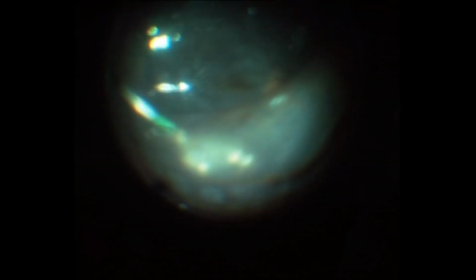The last case highlights how the surgeon managed a case of an old retinal detachment complicated by subretinal air migration. This highlighted an extremely stiff and taut peripheral retina. An initial attempt to remove the air was made through the inferior retinotomy, but failed. Finally, the surgeon decided to perform relaxing retinectomy under air.